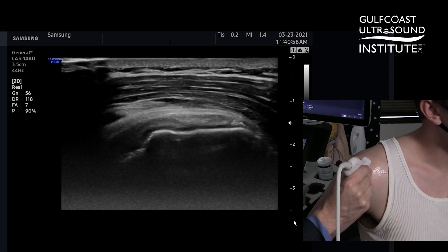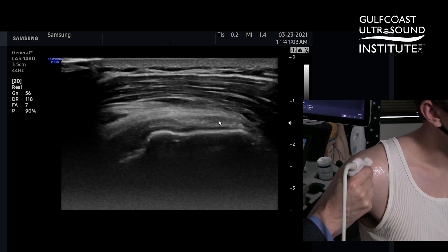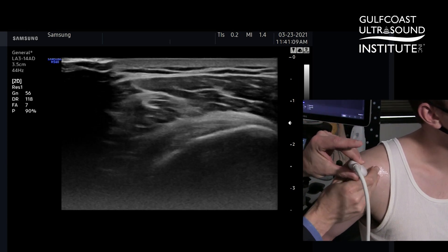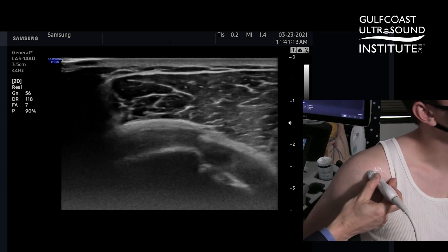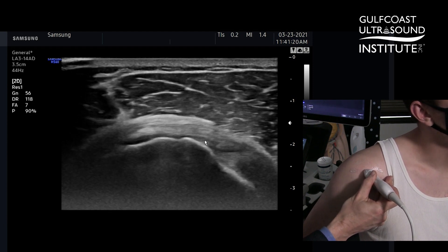It has a flattened appearance and you can see these hypoechoic striations. That tells me that this is the infraspinatus on top of the supraspinatus at the overlap area. The last point is that when I'm looking in short axis, I want to make sure I move anterior enough to see the biceps tendon in the rotator interval to ensure a comprehensive anterior evaluation.